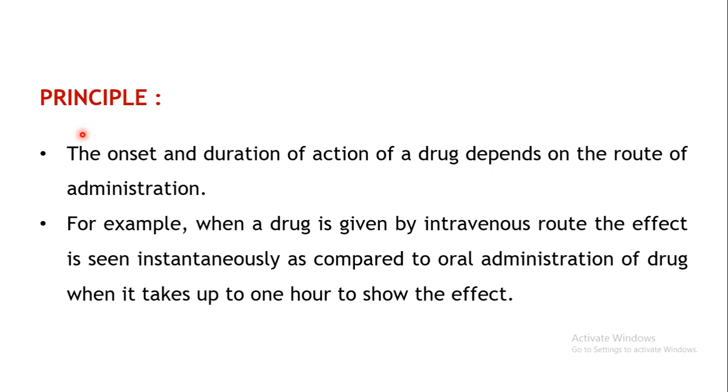Coming to the principle of the experiment. As we have already covered under the theory, the pharmacokinetics and the pharmacodynamics of a particular drug. We have seen that there are certain parameters which deal with the movement of the drug in, through and out of the body, that is the pharmacokinetics. And we have also covered the pharmacodynamics, that is how exactly the drug produces its actions.